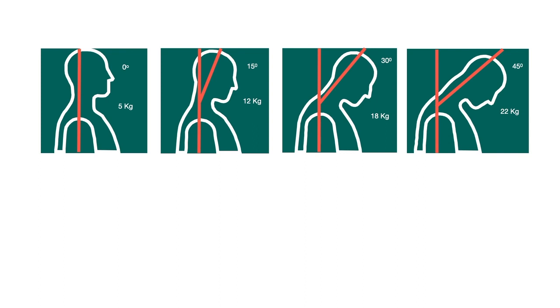Do you remember the previous picture that I showed you? The dentists bend 45 degrees, so they have a force or tension on their neck and muscles of about 22 kilograms. So it is huge. Absolutely, it leads to a physical disorder.